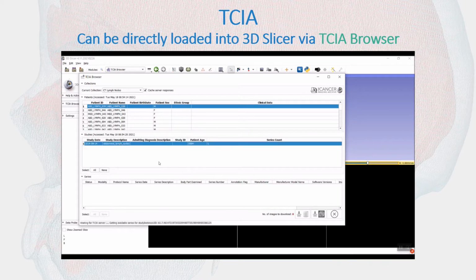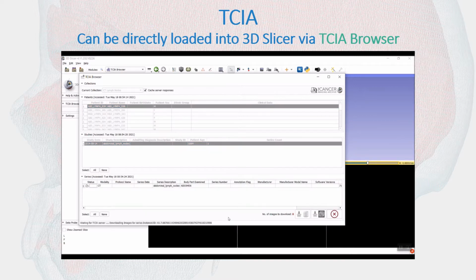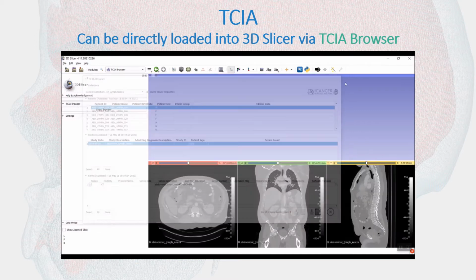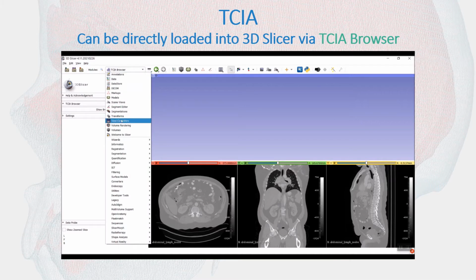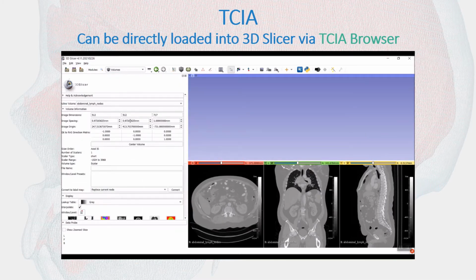This video shows how quickly you can access TCIA data, perform and customize a volume rendering by adjusting the preset values, and clip the volume rendering to visualize specific areas of interest, such as the pubic symphysis. The ease of accessibility can minimize the learning curve for working with CT data and increase the possibility to generate large amounts of quantitative or non-metric trait reference data.